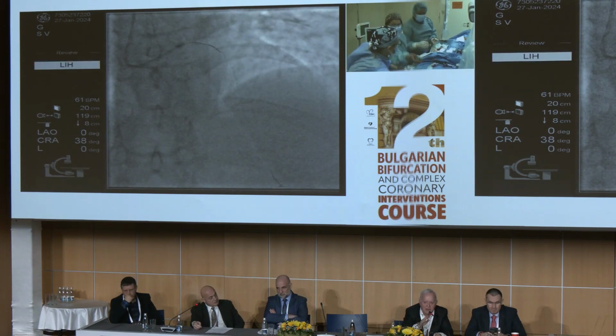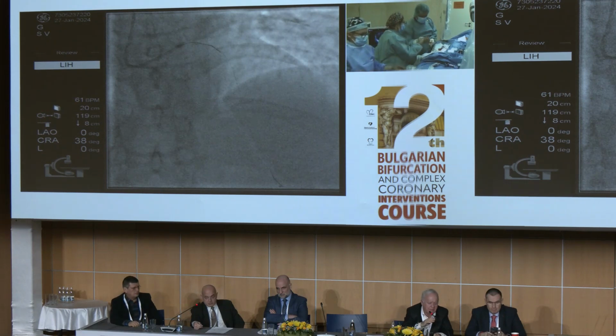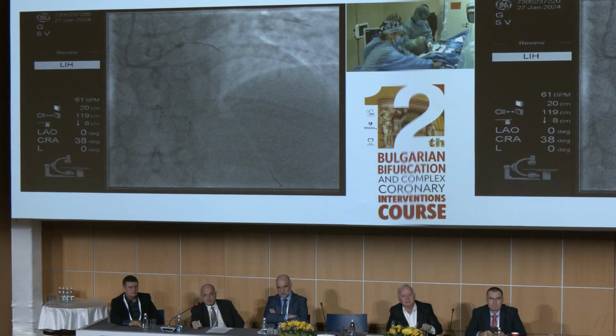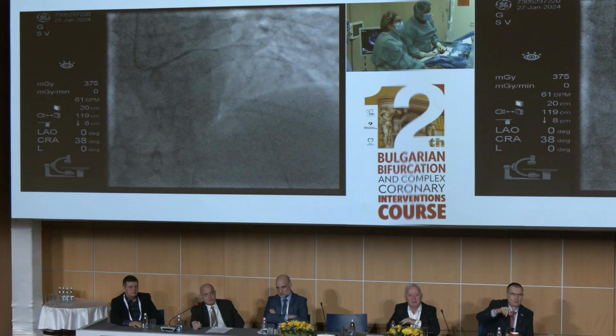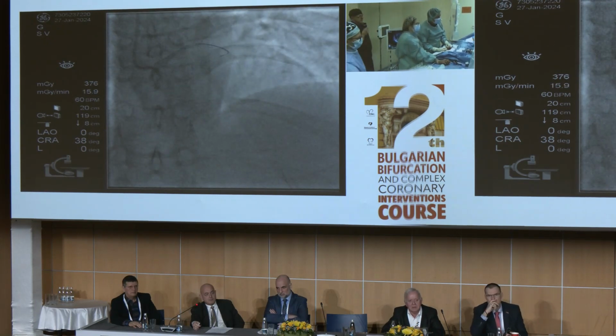Maybe the torque is obtained with a bit damaged wire, and it's more difficult to control as it was before. I don't expect much problems, but let's see.